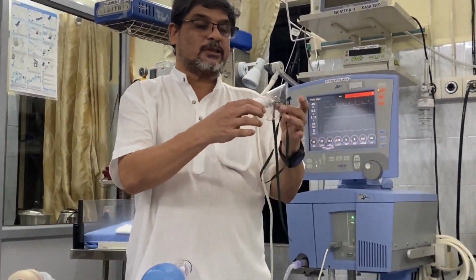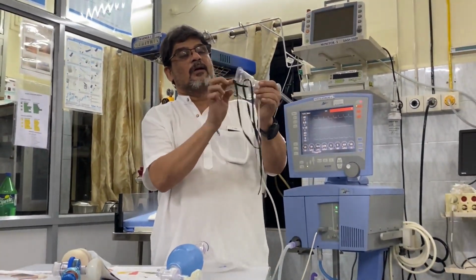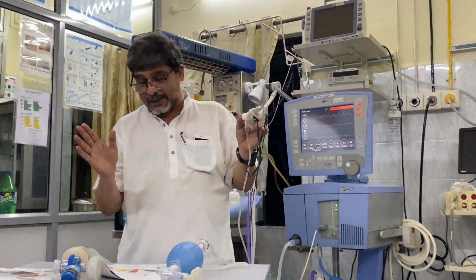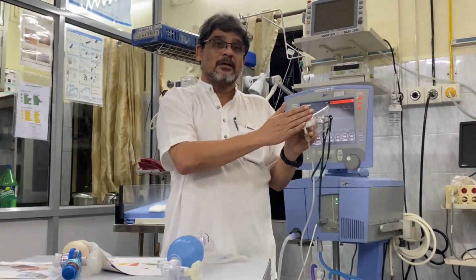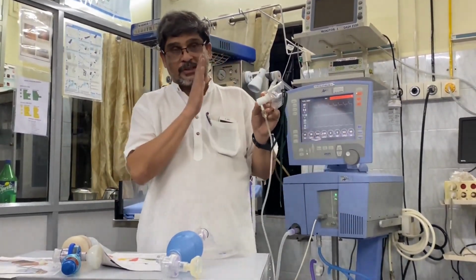This mask has got holes all around, so part of it while breathing goes out through these holes. You can generate FiO2 of 35 to 60%, or 0.3 to 0.6, with a simple mask.